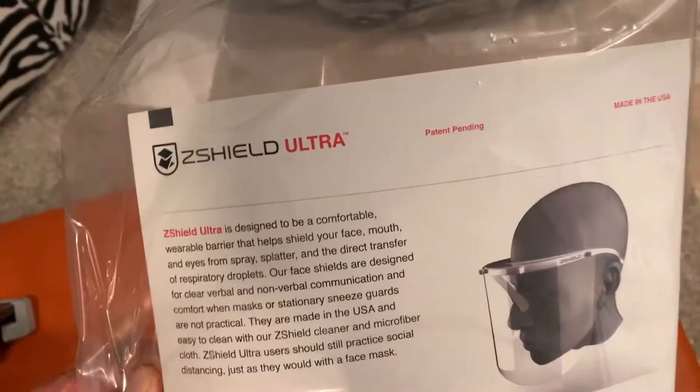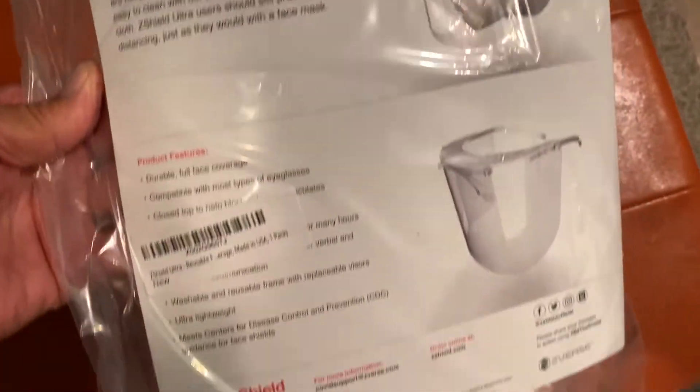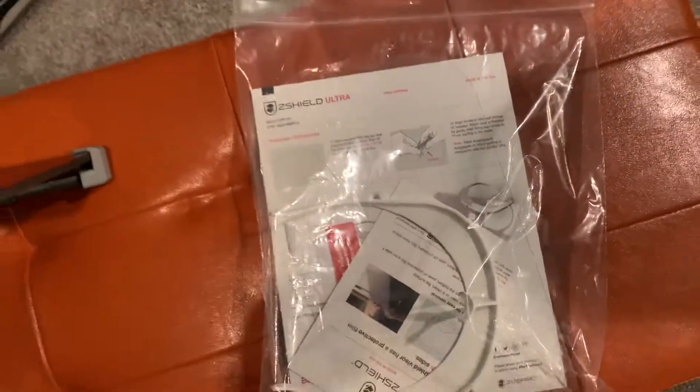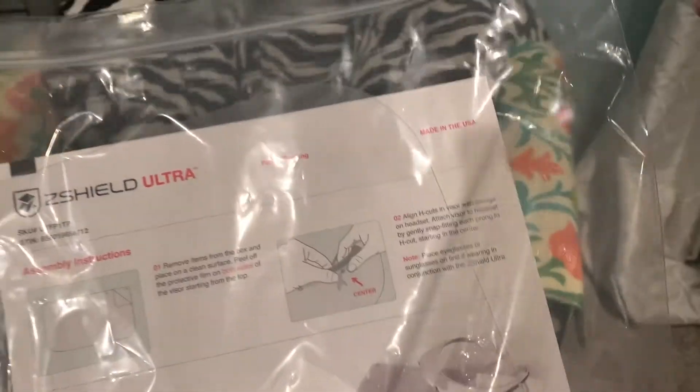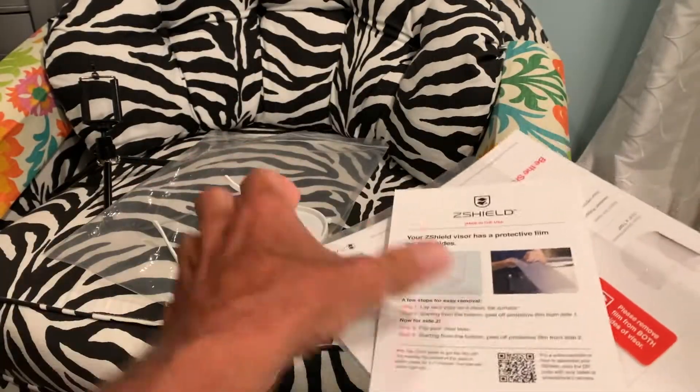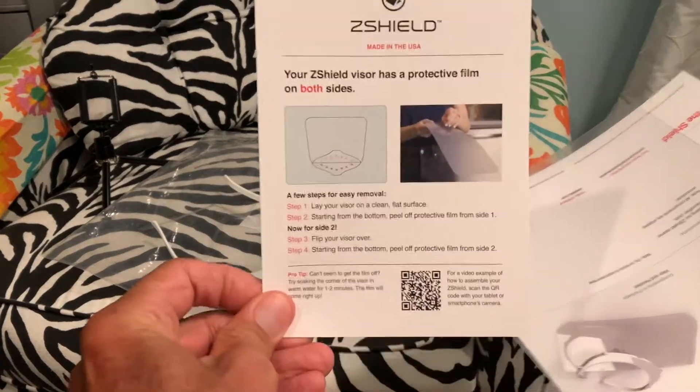All right, so we just bought the Z-Shield Ultra. We're going to show you how to put it together. Let's do it. So we just got to open this thing up — that's pretty simple. Basically it looks like it's just two pieces.